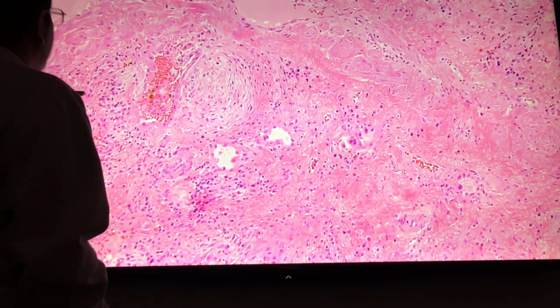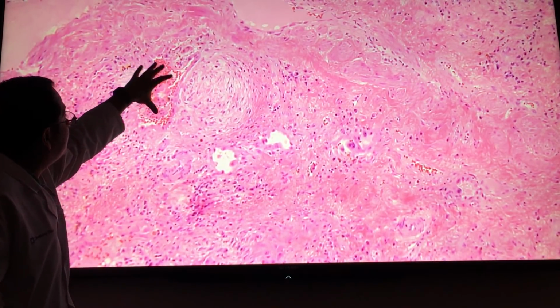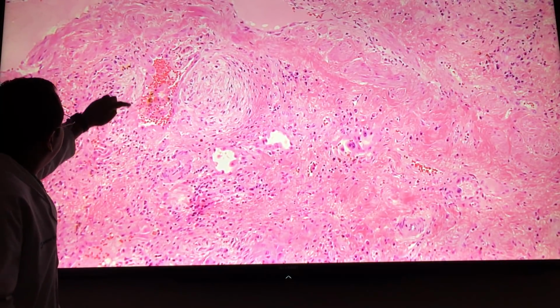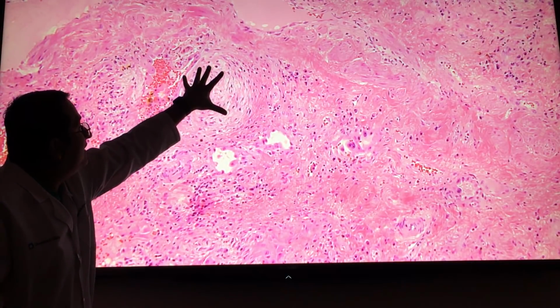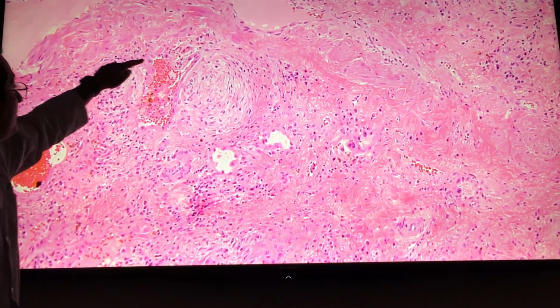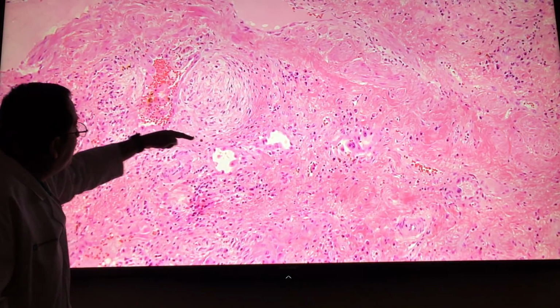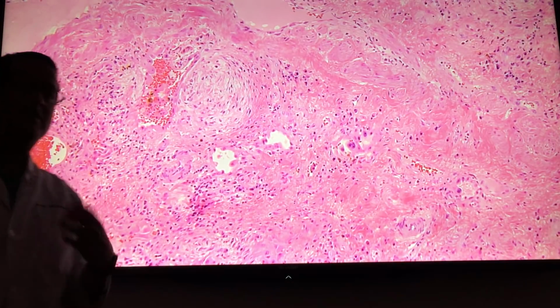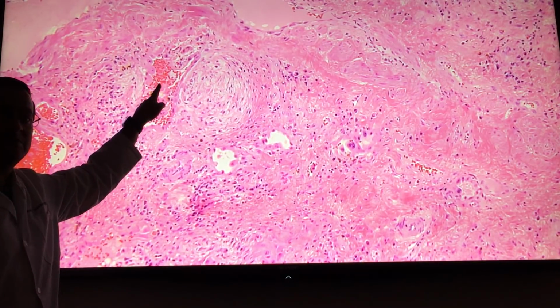So see, fibroblast foci, there is actually air space here. See where those macrophages are? This is air space. That's the alveolar pneumocytes. See those? Very prominent. So what's that? Interstitial. So that whole fibroblast focus, it's like a dome. It can also have a dome on the other side, or it can be flat. It doesn't have any inflammatory cells in it, plasma cells, histiocytes. So that's one thing that goes against organizing pneumonia. It's in the interstitium, not in the airspace.